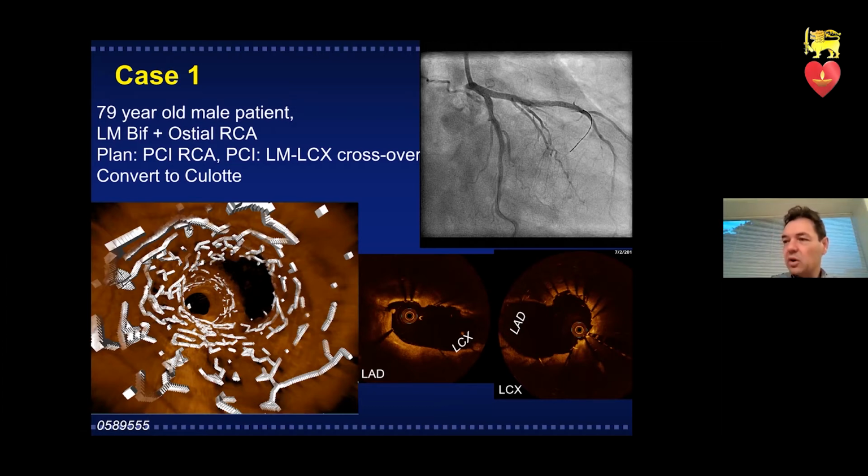The data, you know, that you have to reach 8 square millimeters in the left main and 6 in the LAD as an end result, are IVUS based. So if you use IVUS guidance for optimization of your left main bifurcation, you know you have hard data to work on. So both have their arguments. The OCT, if possible, gives you the highest quality images, but IVUS is still workable.